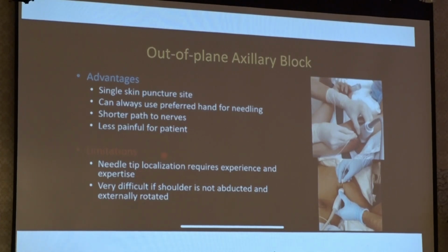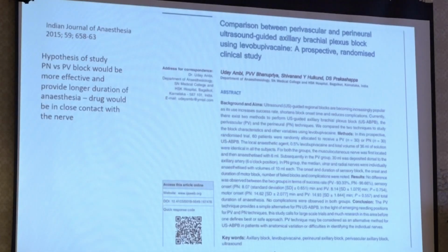The advantage is that you can keep and monitor the needle tracking. The limitation with out-of-plane is that needle tip localization requires experience and expertise, and it is very difficult if the shoulder is not abducted and fully externally rotated.